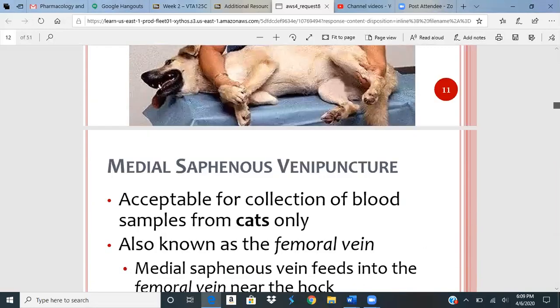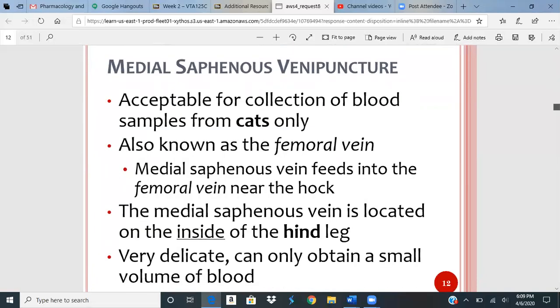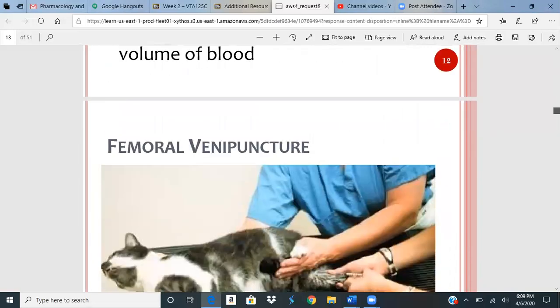All right, medial saphenous venipuncture for cats only, or the femoral vein, inside that hind leg, and then usually it's going to be a small amount of blood. That particular vein is very small in cats. It's kind of hard to see. You have to put alcohol on the leg to flatten down the fur, and then you move it to one side or the other to even make the vein visible.